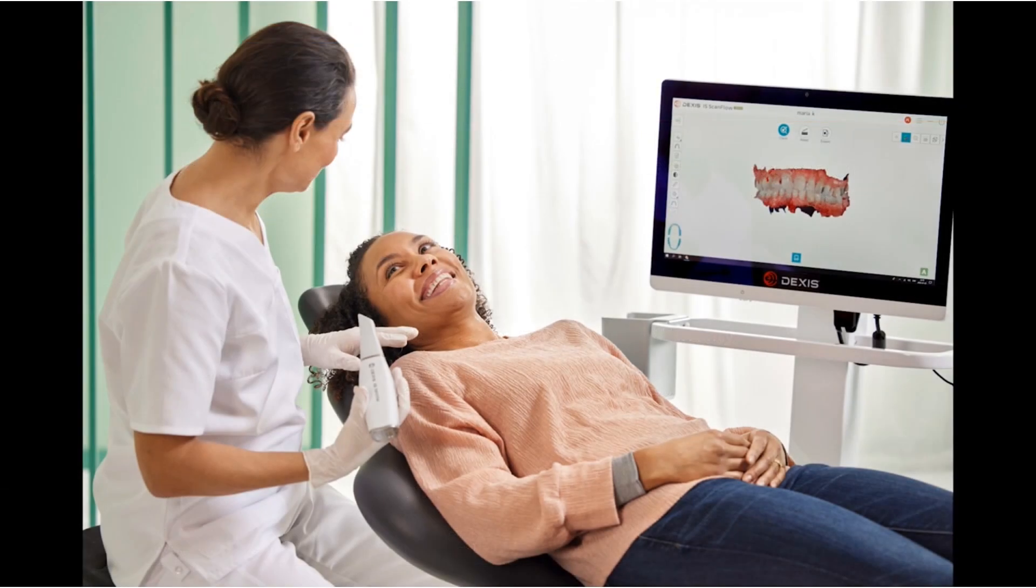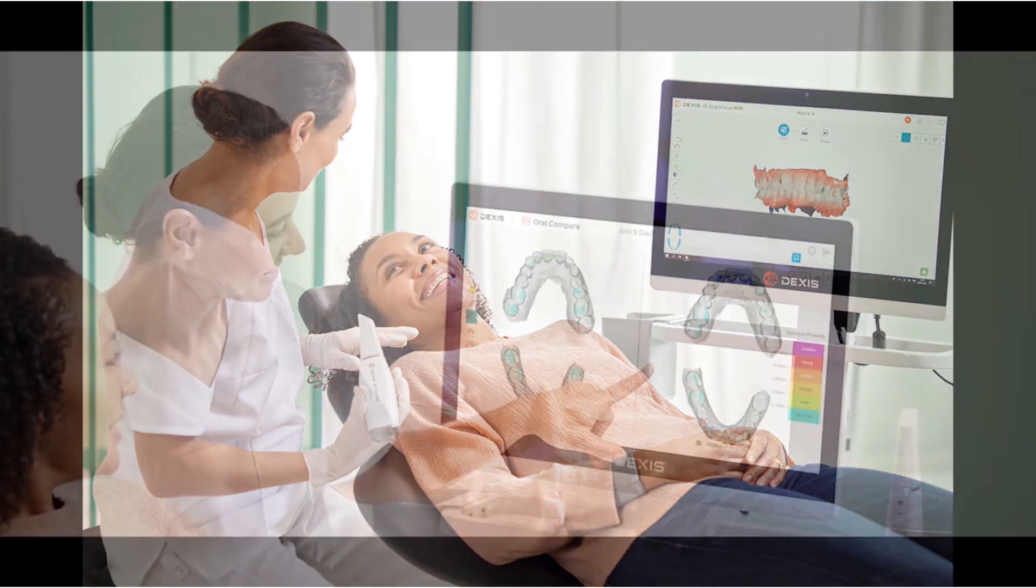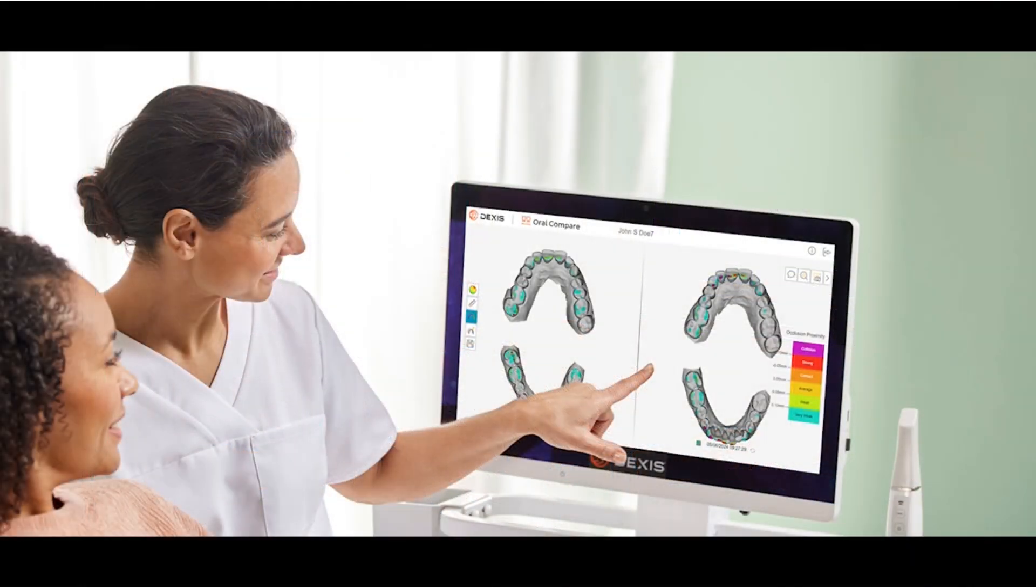IS Connect Cloud enables workflows to be started while the patient is chair-side and completed later. Whether at the office or at home, cloud access simplifies the workflow.